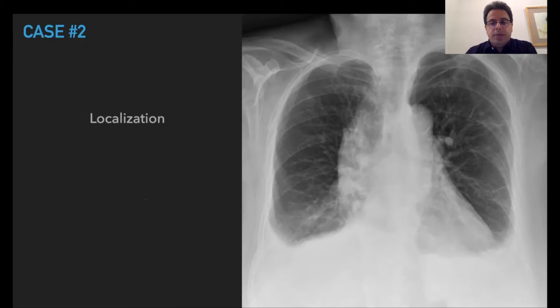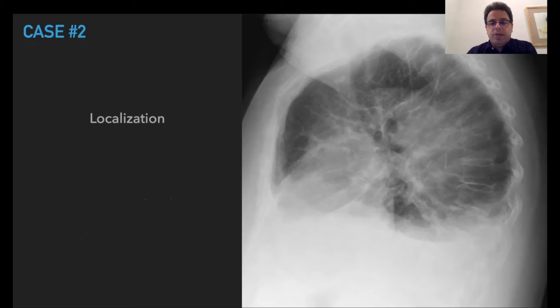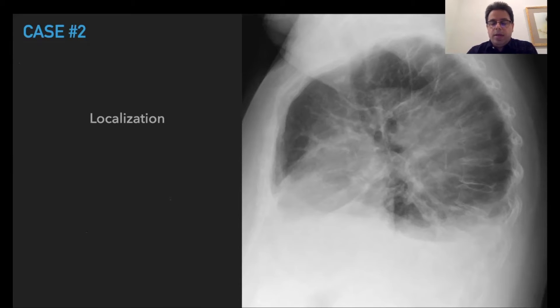In case number two, the PA chest x-ray shows that the mediastinum is wide. On the lateral view, there is pleural effusion, some atelectasis, and a mass-like opacity over the posterior mediastinum.